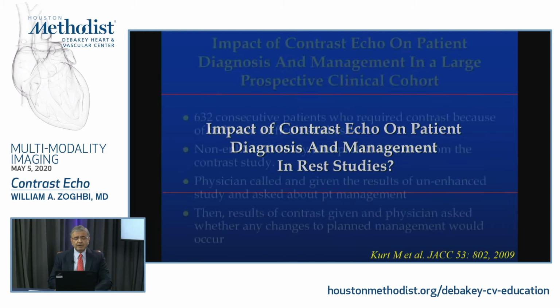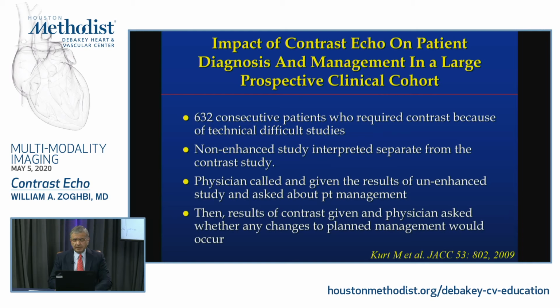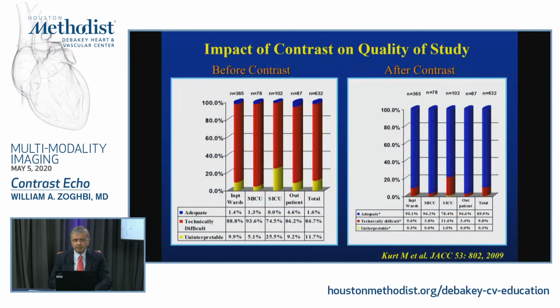What is the impact in resting studies? This is a study by Dr. Kurt, who came to us from Turkey. Really a very nice study that he did on 630-some consecutive patients, where we asked the question whether contrast will change management. This is a resting study, not stress, published in JACC. In yellow are uninterpretable studies. In red are technically difficult studies, okay? By design, it was technically difficult studies in the vast majority, and the sonographer made that determination of when to use contrast.